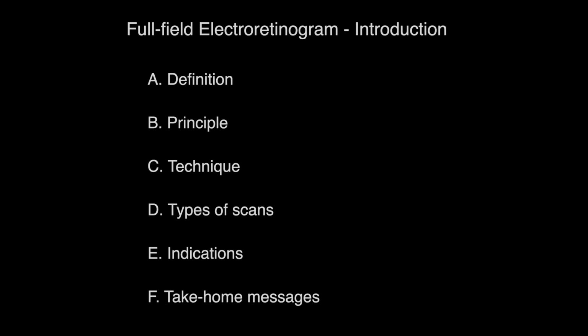The main indications of full field ERG are retinal dystrophies. The exam allows us to differentiate and exclude patients who do have and do not have retinal dystrophy. In addition, you can direct your differential more towards rod or cone mediated retinal dystrophy.